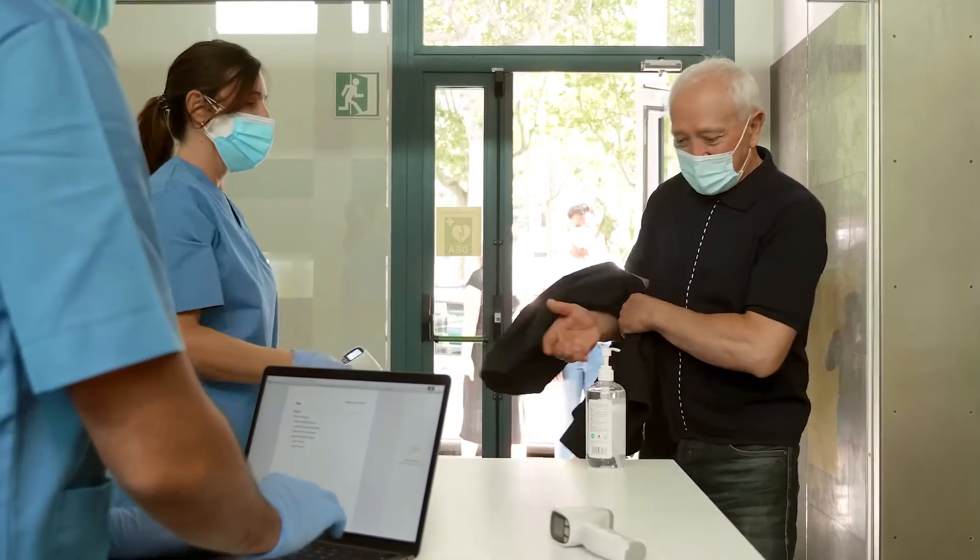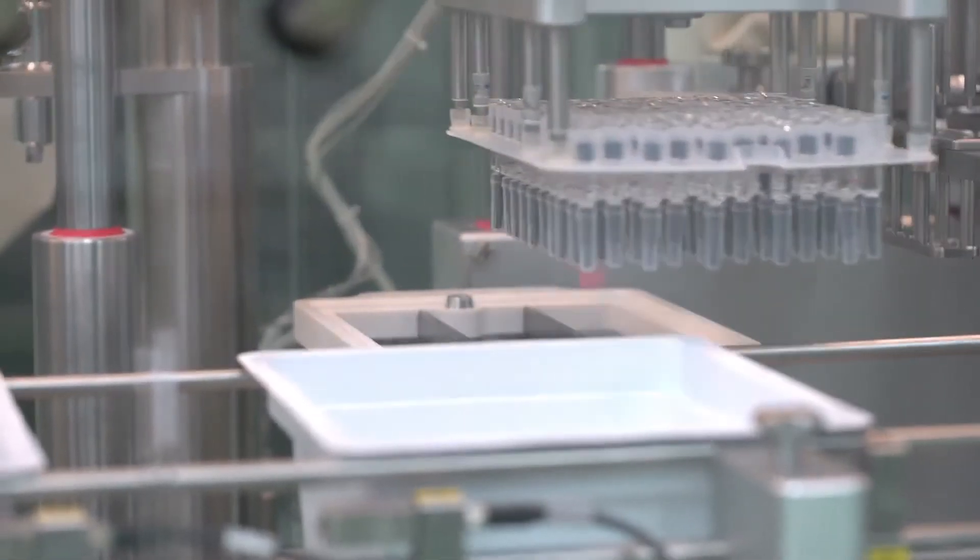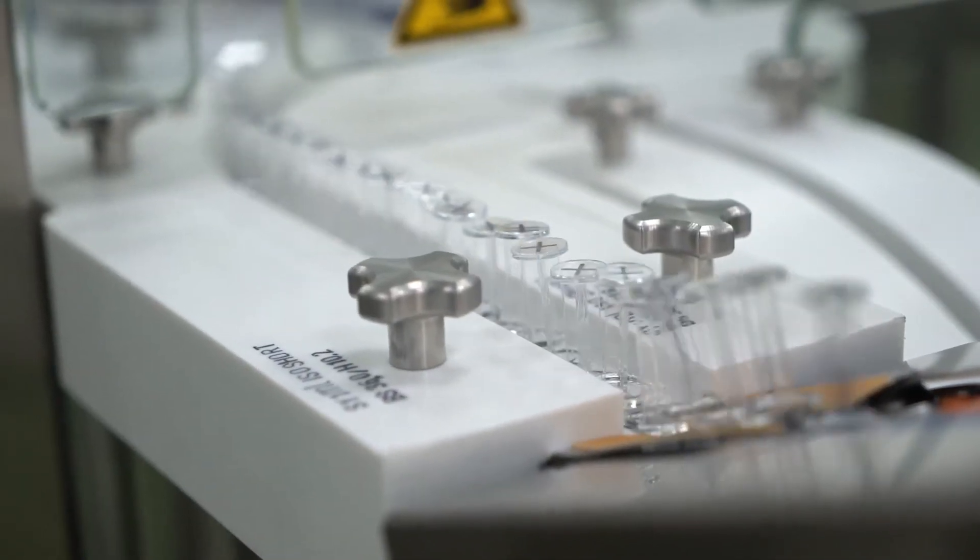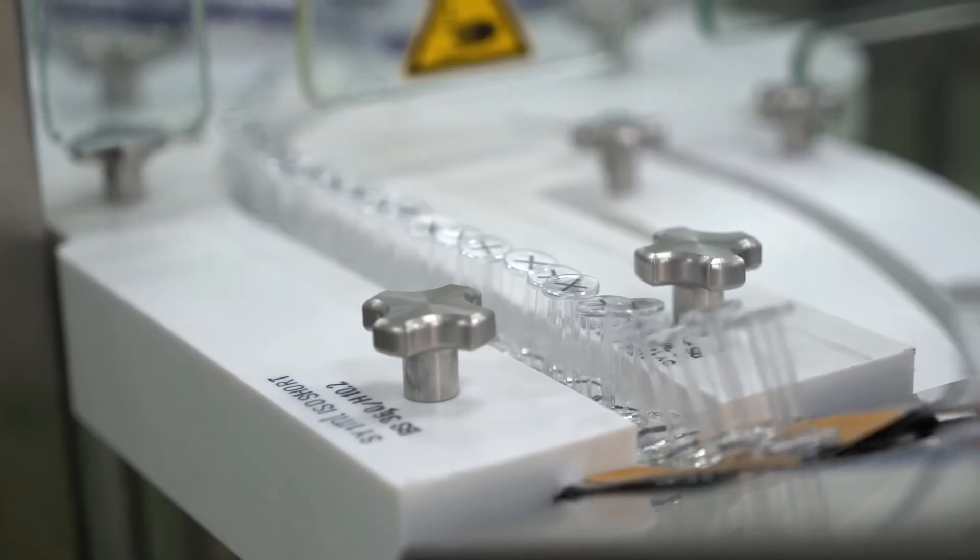Ramping up production of syringes has been a challenge which manufacturers have pulled out all the stops to meet. But with increased production comes increased testing.